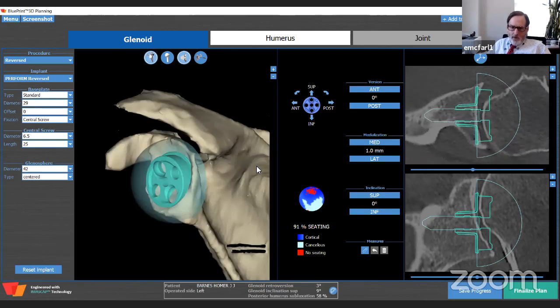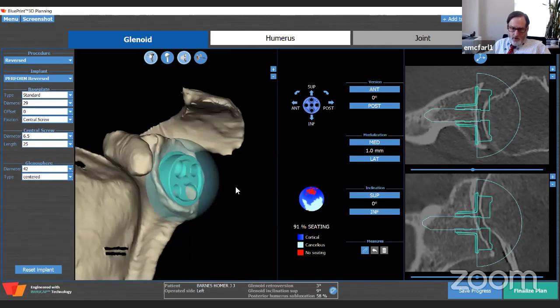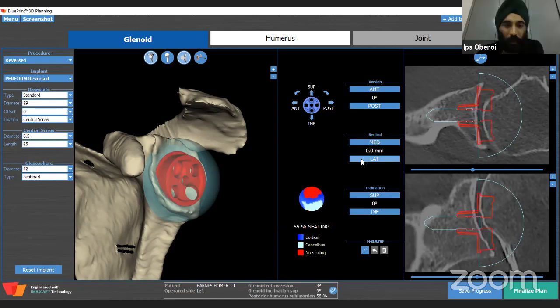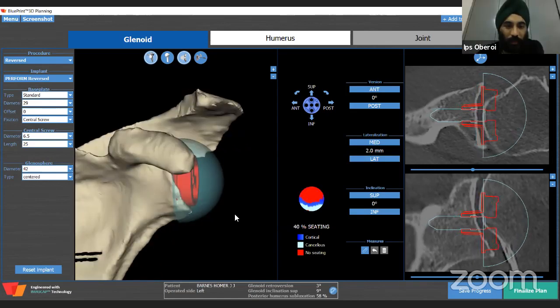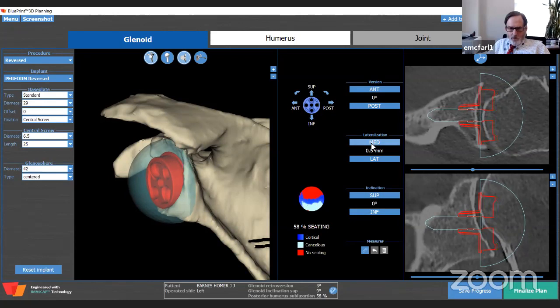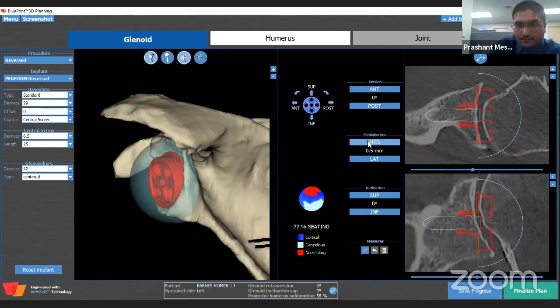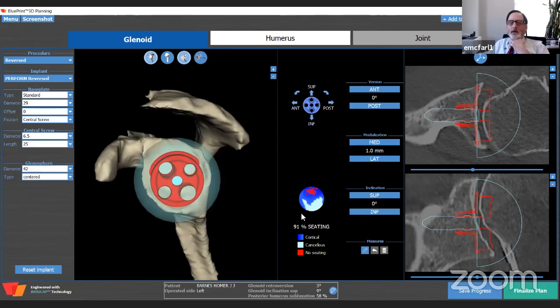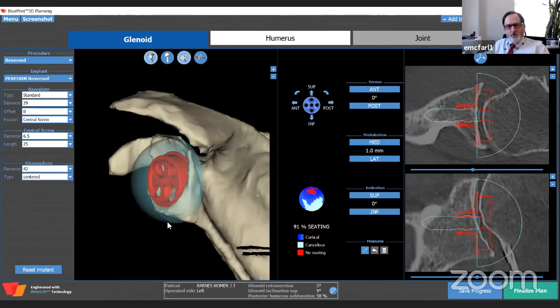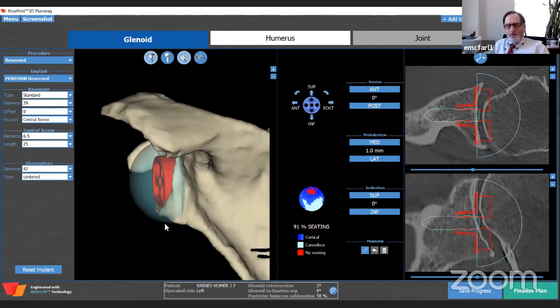if you medialize this guy right here, it looks like you're taking a fair amount of bone off. But this patient's glenoid is fairly medialized, and you can ream it flat like this. How much coverage do you get down there? It's about 91%. Yeah, if you ream it flat, you get about 90%. And in this situation, the posterior inferior screw, you probably couldn't get that in. I don't worry about that.